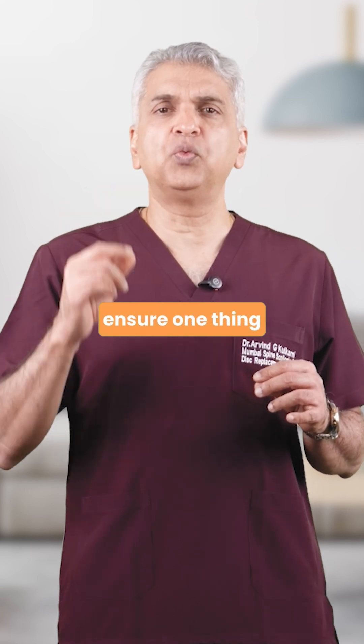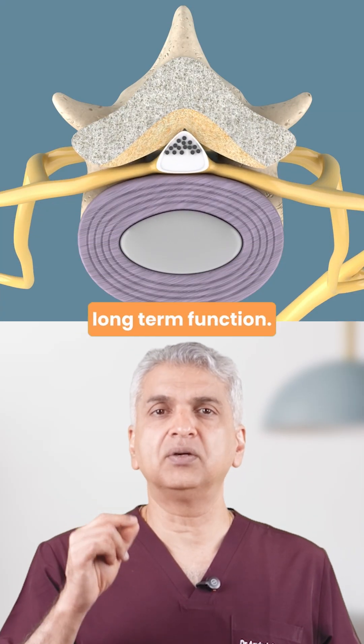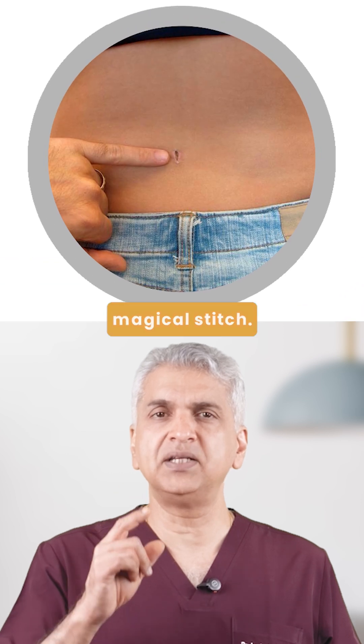Throughout the procedure, we ensure one thing above all: the nerve is fully decompressed. That's what relieves the pain and protects long-term function. All of this in one magical stitch.